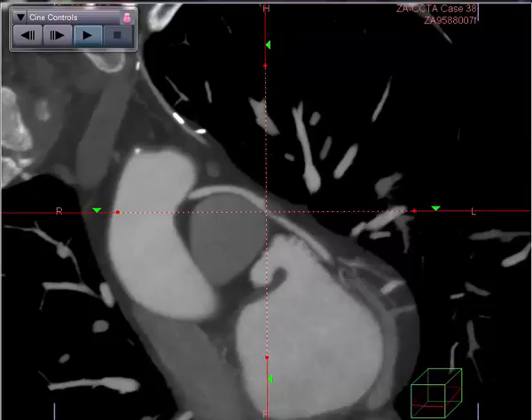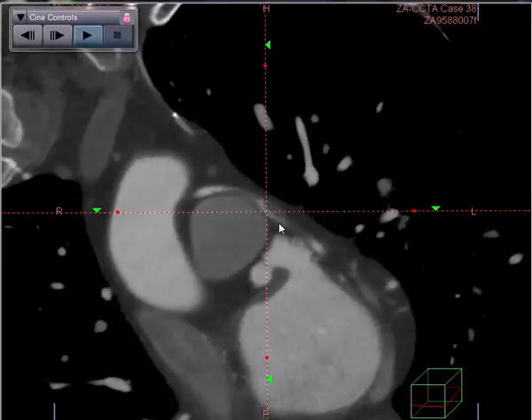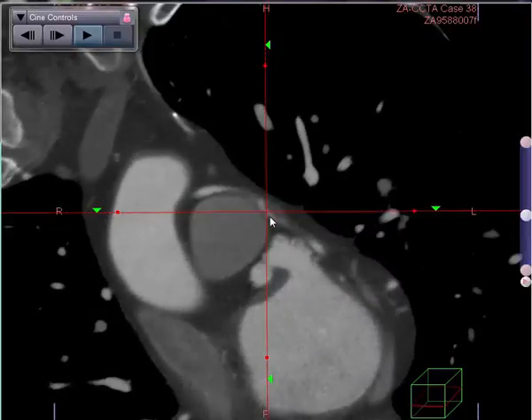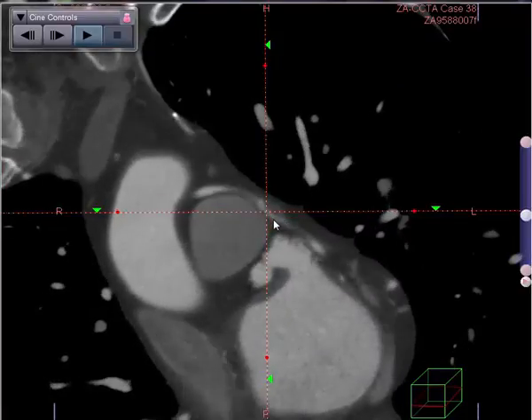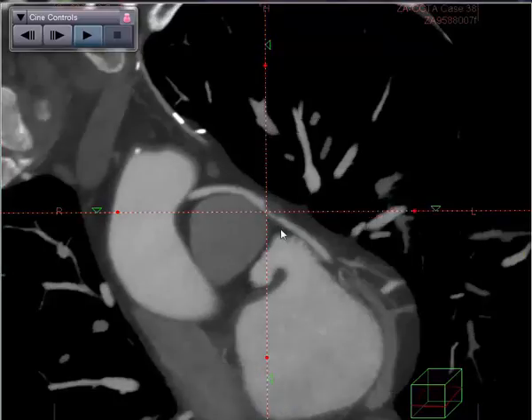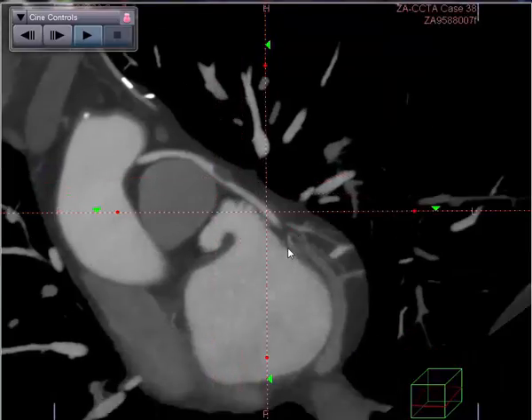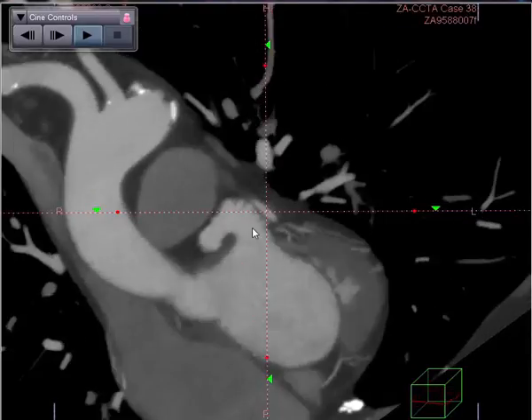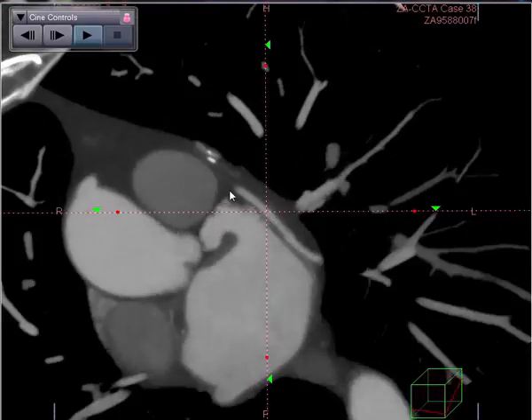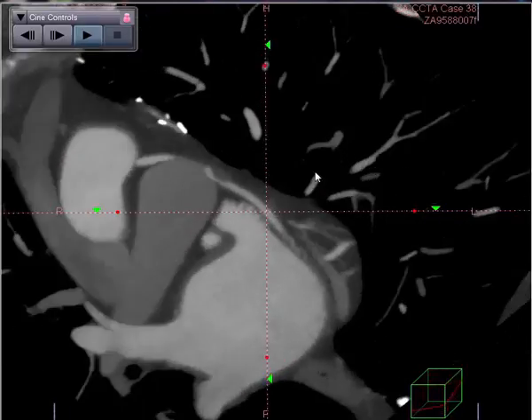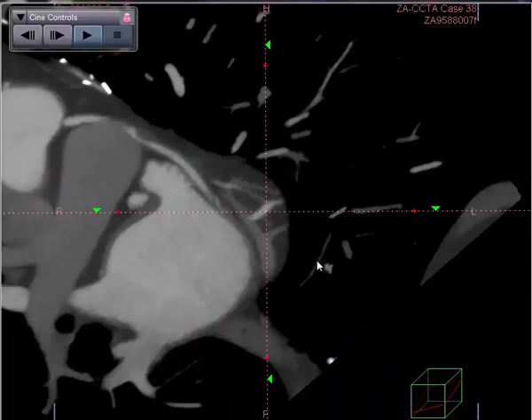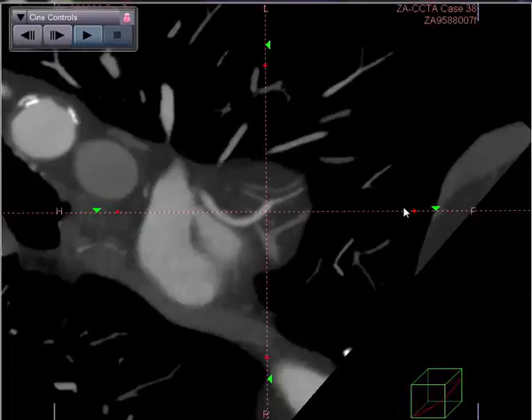I can switch to an NPR view to try to get a little better view — a very small vessel at that point. Back to a 5mm MIP. If we look at the remainder of the graft, we can follow it down, and it is otherwise widely patent going over to the obtuse marginal region and having good distal flow.